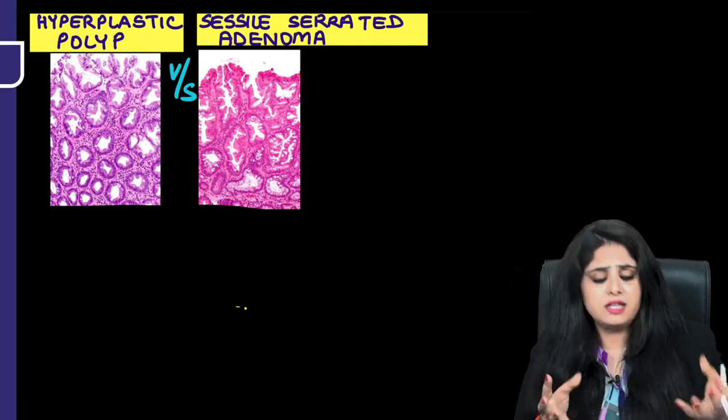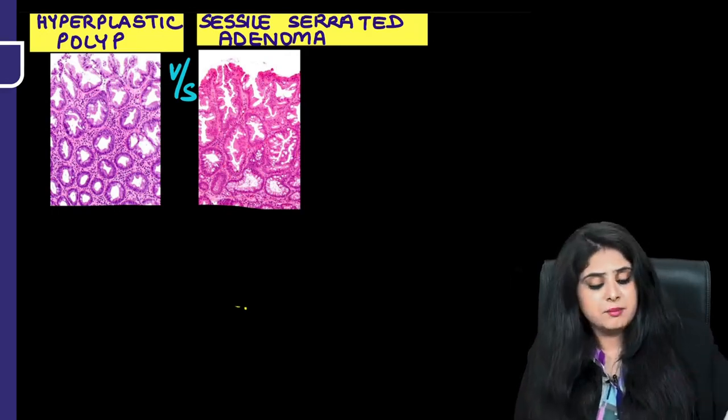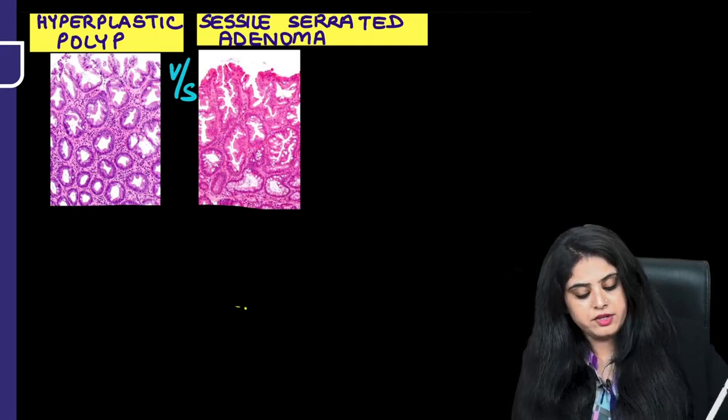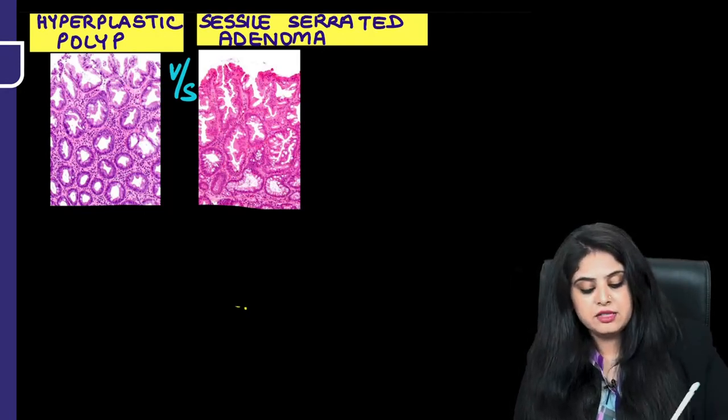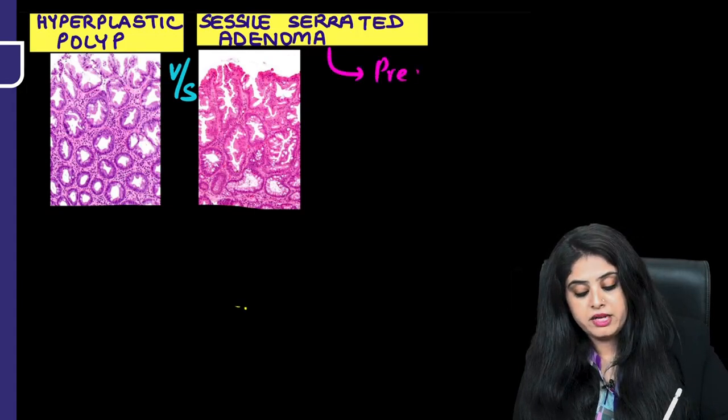Quick doubt, ma'am. Why are you comparing these? Because the hyperplastic polyp over here is non-cancerous. This is non-neoplastic. Sessile serrated adenoma is precancerous. That is why I am comparing it.